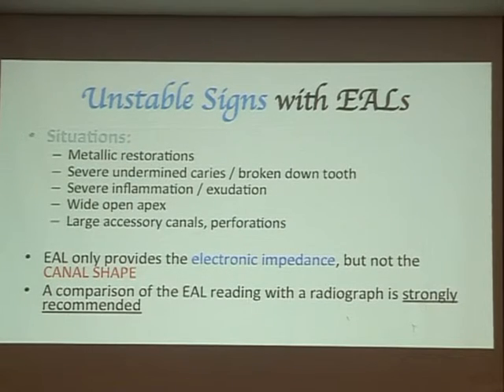Sometimes it doesn't work, okay, if you've got a big metallic filling or there's a crown, for example, because the machine measures electricity. So some leaking fillings also give false readings.